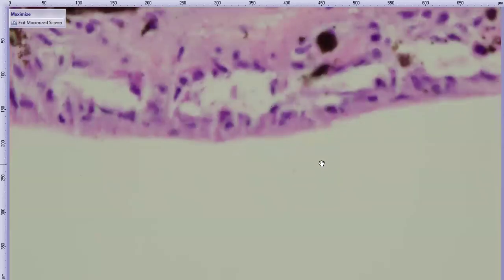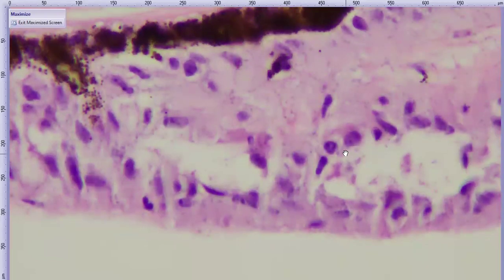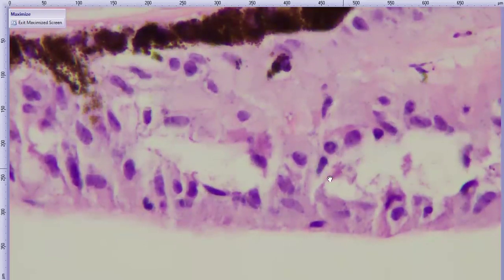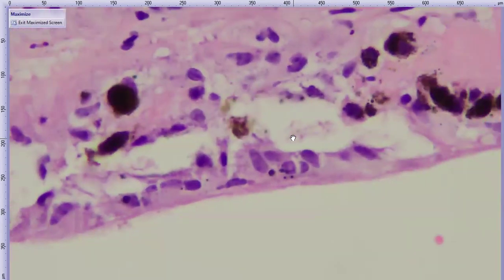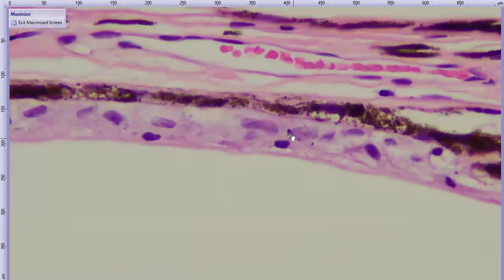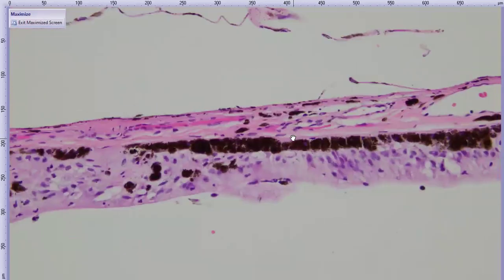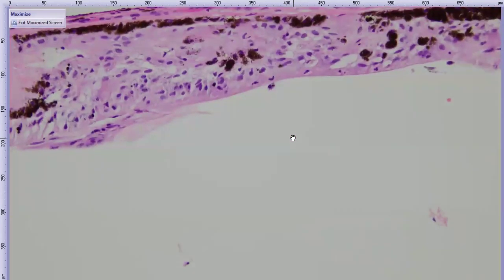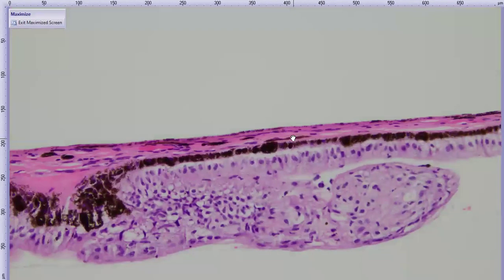Another thing that we often see is what we call Cooley bodies. And again, speaking of Coplowisms, Cooley bodies are these linear intracytoplasmic inclusion bodies. These are probably non-specific immune-related crystalline material that accumulate in the cytoplasm of the non-pigmented epithelial cells. Again, this is not the best example of it. And if you Google Cooley bodies, you will probably be redirected to a Coplow PowerPoint or something like that.